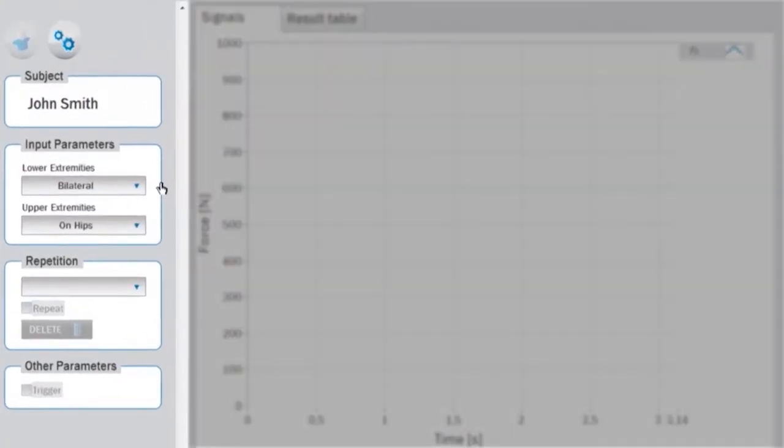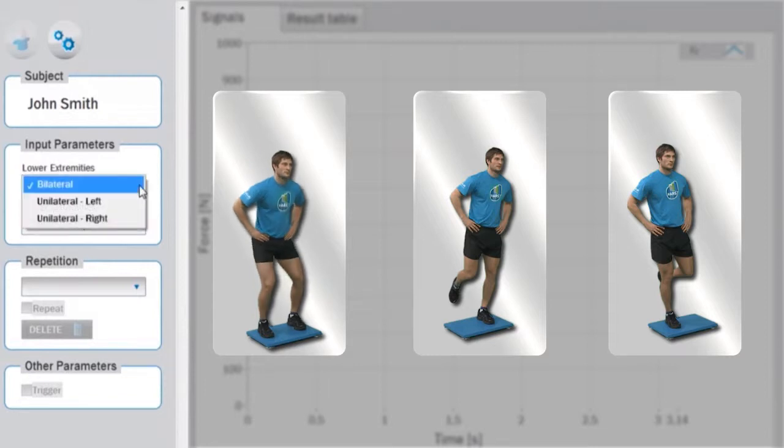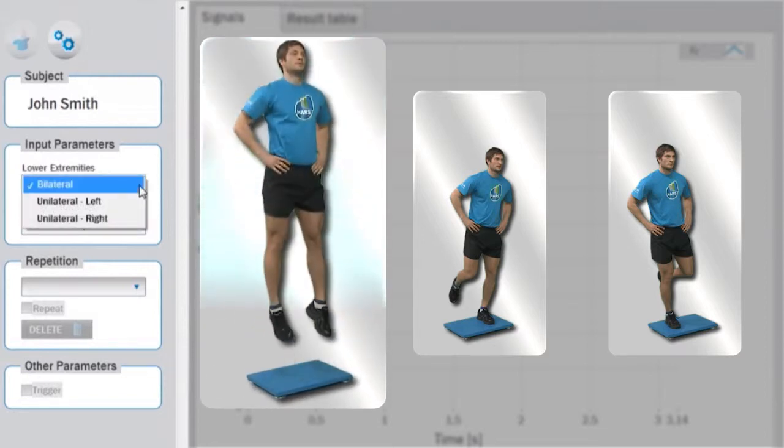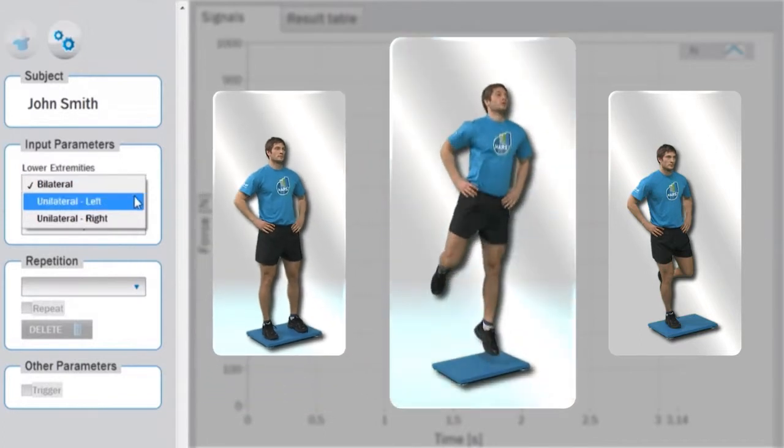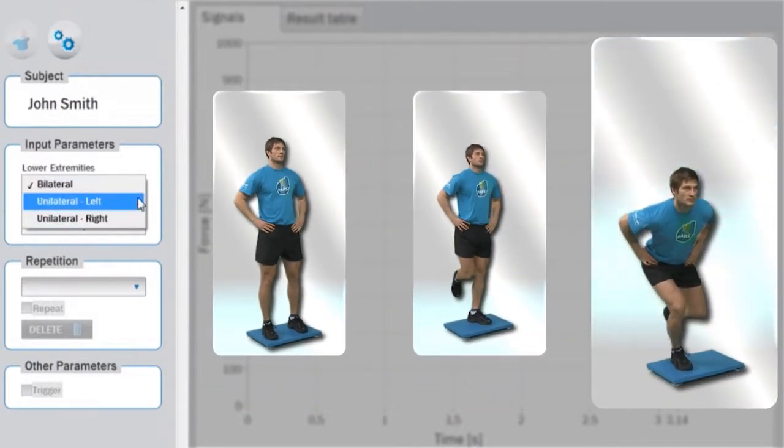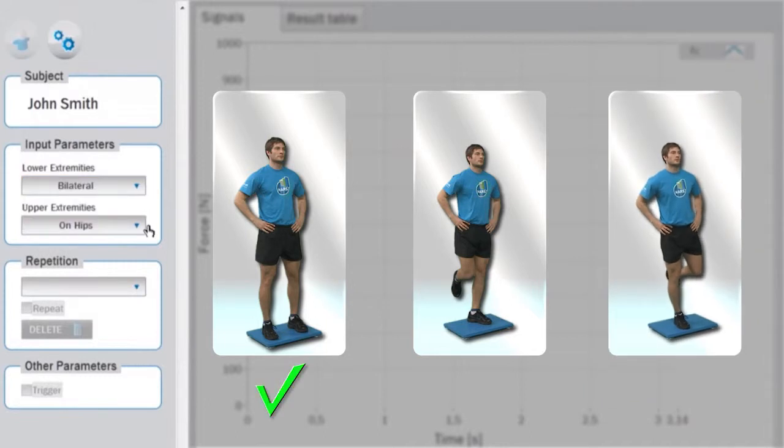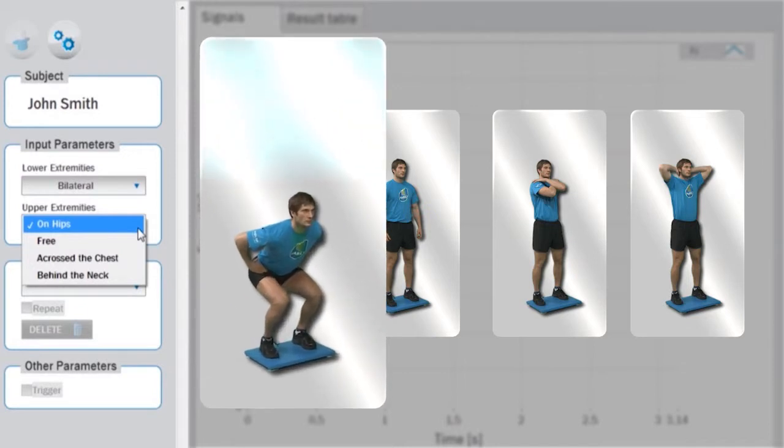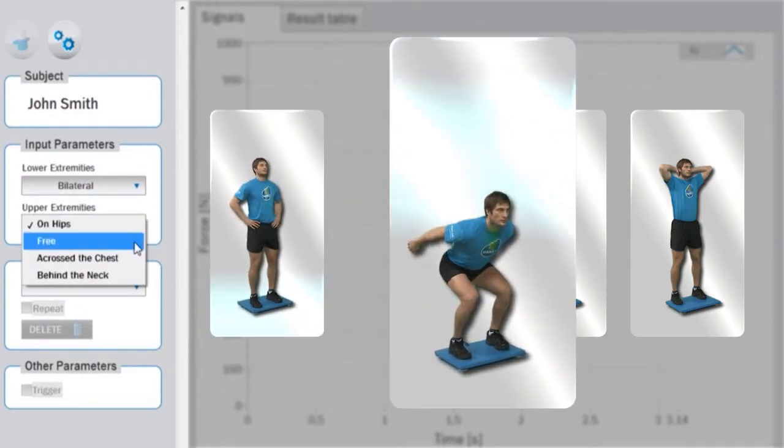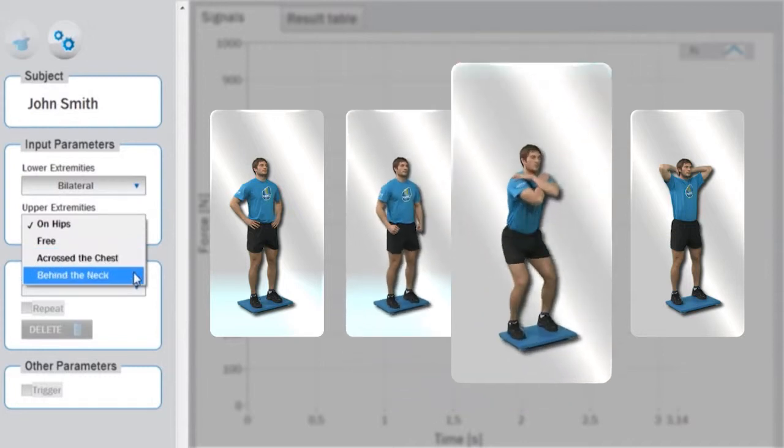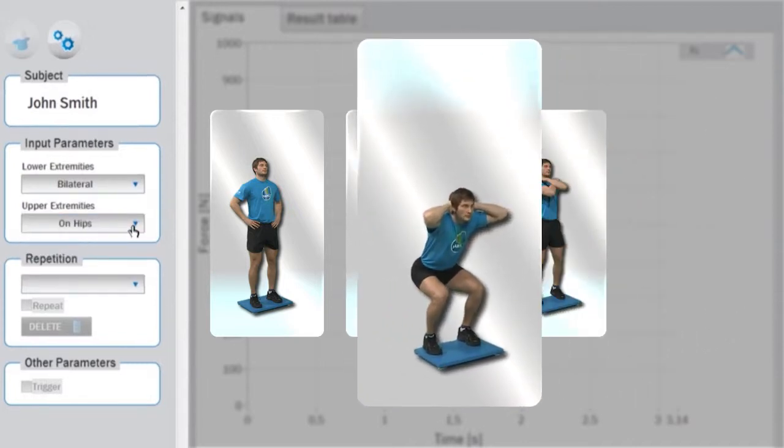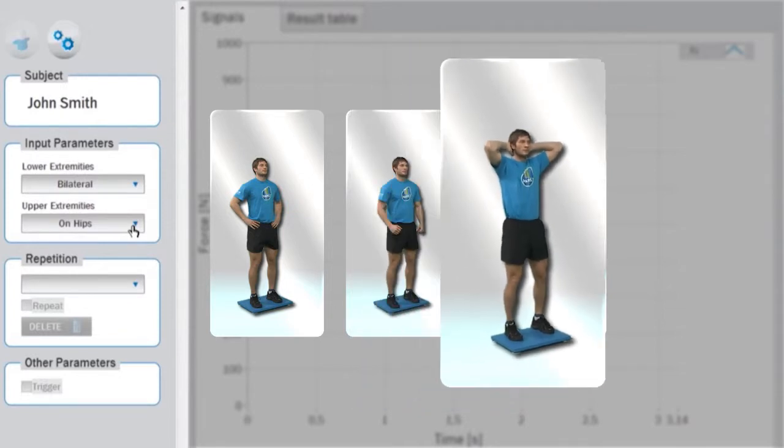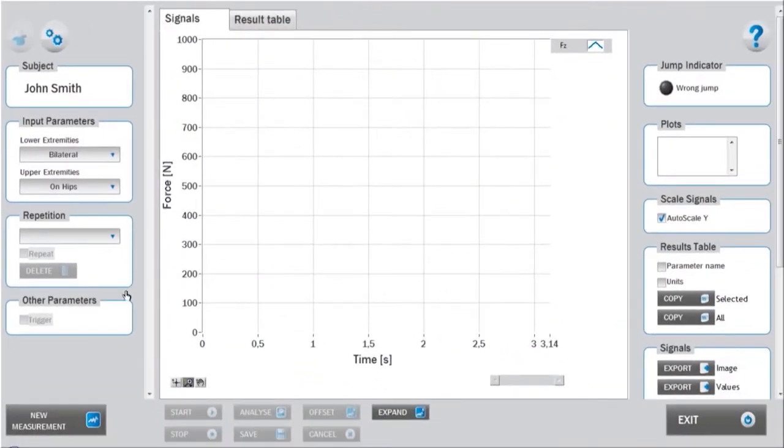These parameters are lower extremities, where you can choose among bilateral jump, jump with the left leg, or jump with the right leg, and upper extremities, where you can choose among hands positioned on the hips, freely positioned, crossed over the chest, or positioned behind the neck.